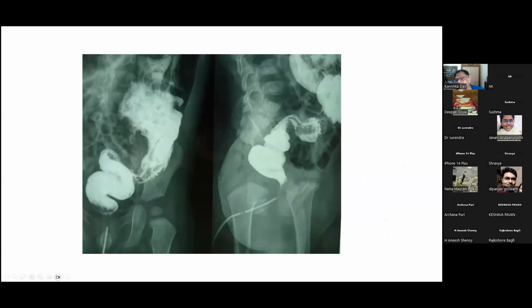Yes, Supraja. Sir, this appears to be a distal rectal contrast study taken in oblique position. We can see contrast entering from the rectum into the sigmoid, which appears to be not dilated. Then in the mid-sigmoid level, there's a transition zone and sudden dilatation of the proximal sigmoid. Most likely short segment Hirschsprung disease. Dilatation of what? Of the proximal sigmoid or descending colon.